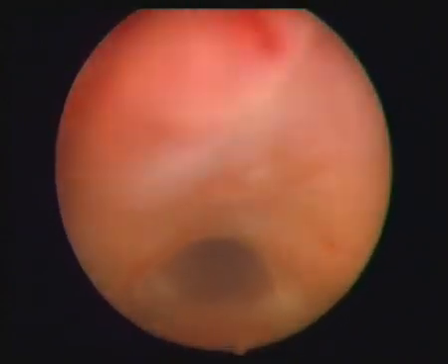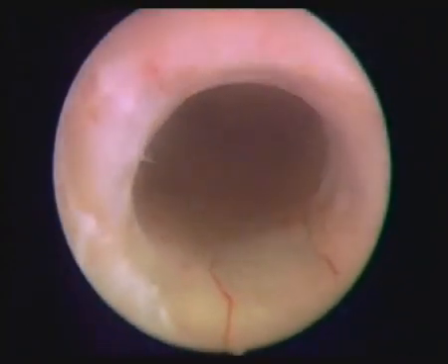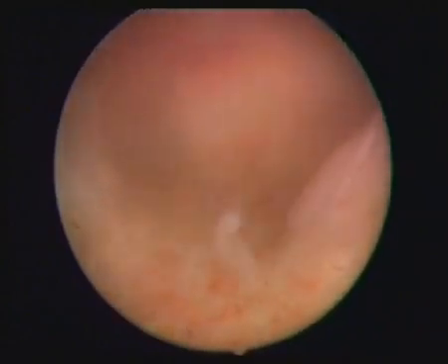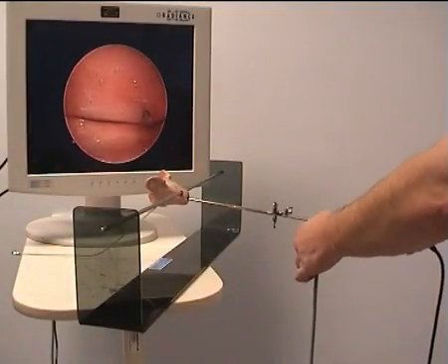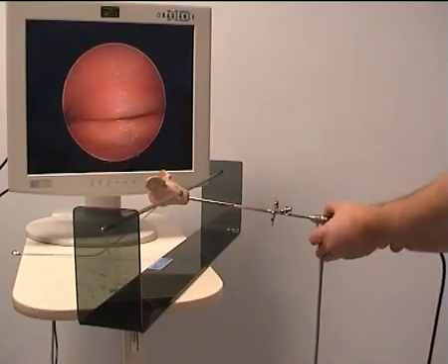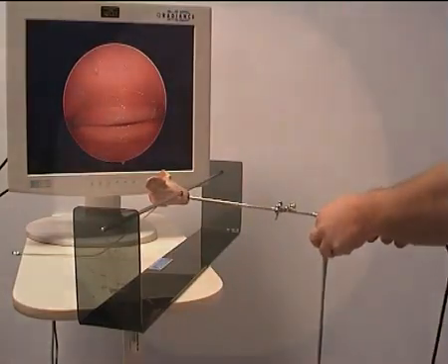The scope is advanced to the uterine fundus and refocused. In contrast to the small vertical and horizontal movements used to negotiate the cervical canal, inspection of the uterine cavity is made primarily by rotational movements of the scope. To view the left cornu and tubal ostium, the light lead is rotated 90 degrees to the left, as is the notch on the screen. The light lead is rotated 90 degrees to the right to view the right ostium.